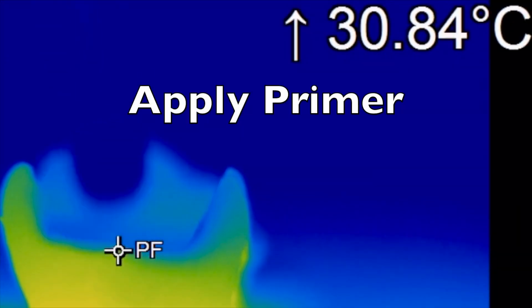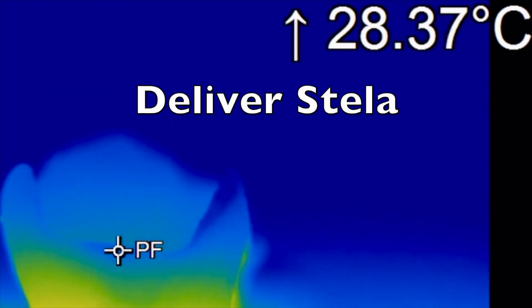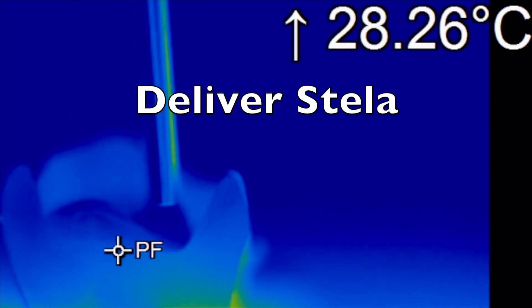Here we can see the Stela Primer being applied to the tooth and then it's going to be air dried. We're now injecting the Stela into the cavity.